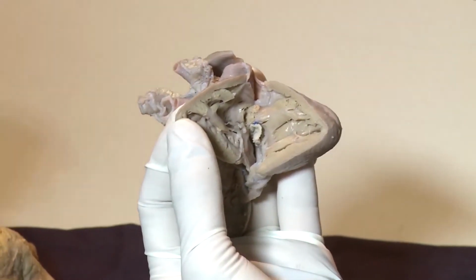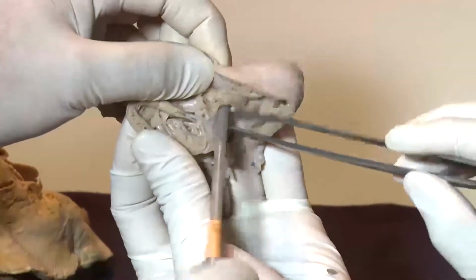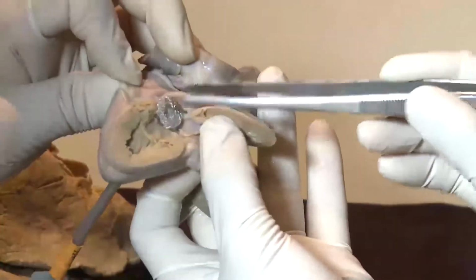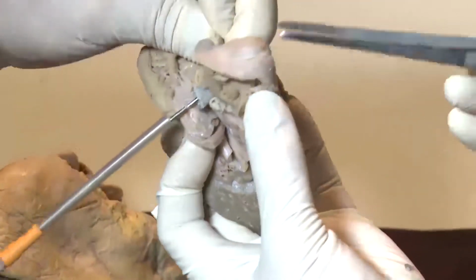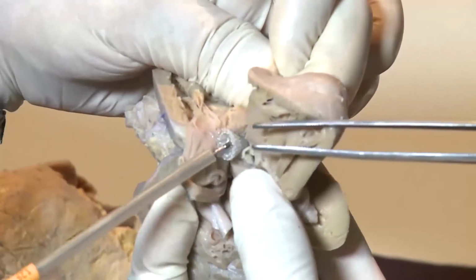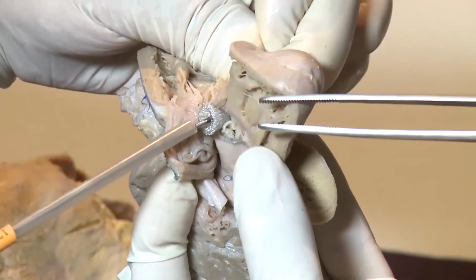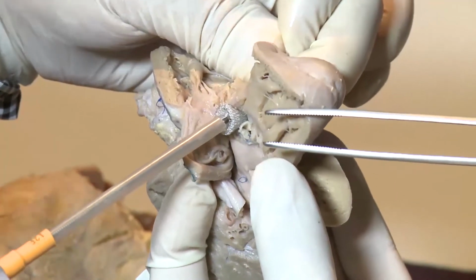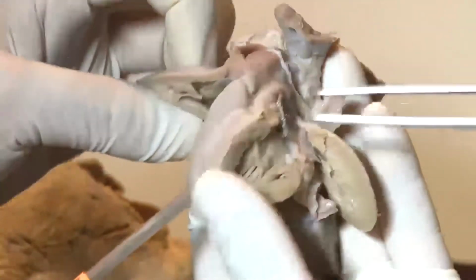So this is the PDA device. I cross it. It's a little bit bigger one, and I open it, and on the left side, it's okay. On the right side, I should show you that it does not touch the AV bundle like this. There is no disc. It just protrudes to the RV side. It may not touch the His bundle, so it may be safe. It is safe from the right side, but the problem will be from the left side.